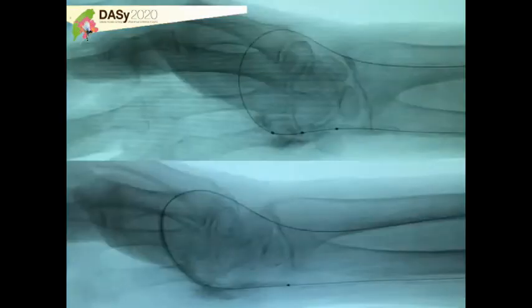We tried to advance the wire to make the palmar loop, but we could not succeed. You can see perforation. Then we advanced the wire to the radial artery to make the loop and performed palmar loop angioplasty. In the final result, you can see good flow to the radial and ulnar artery, good flow to the palmar loop, and improved blood flow to the fingers.